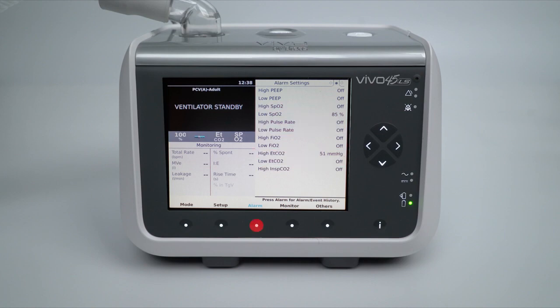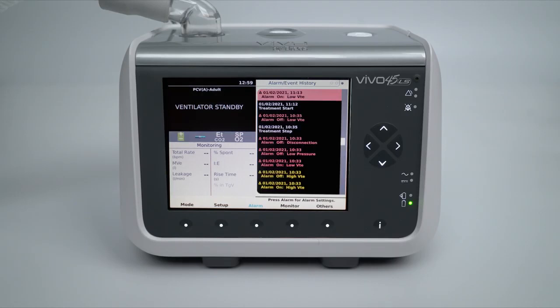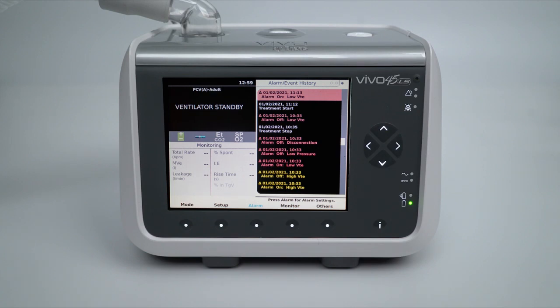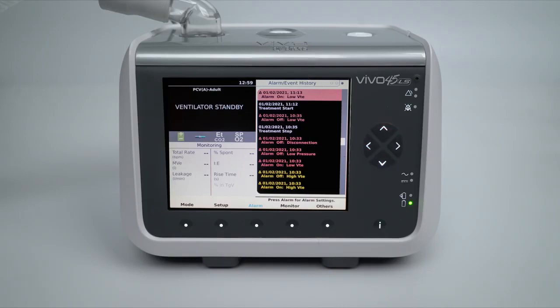By pressing the alarm menu button again, the user will move to the third tab to view an alarm and event history. The most recent activated alarms or logged events are listed at the top. Each alarm and event that occurs on a Vivo 45 LS is recorded with a date and time stamp. In addition, each alarm and event are color-coded to assist the user in viewing the logged occurrences. Events illustrated in white indicate changes to the ventilator modes and settings, changes in the power source, and results of pre-use testing. Events illustrated in red or yellow indicate an activated alarm — the type of alarm, date and time of activation and reset is logged. The event history stores the last 200 logged events and can be viewed individually by using the up and down navigation keys, or page by page by using the right and left navigation keys.